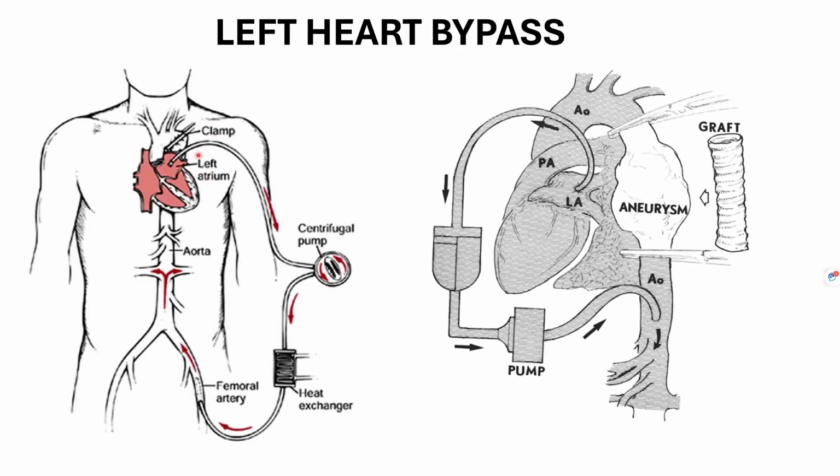So here you can see again, there are a few more things added in the circuit, and this again depends upon surgeon preference, or sometimes if they don't have the option of making selective circuits, they might end up using the full cardiopulmonary bypass circuit. But this is where it can be confusing, because they might say they use the whole circuit, but in your op notes, in your perfusion record, or in your anesthesia record, you will see that the right lung is being ventilated, the heart is not arrested, and you will see that the cannulation sites are all on the arterial side of the circulation or left side of the circulation.